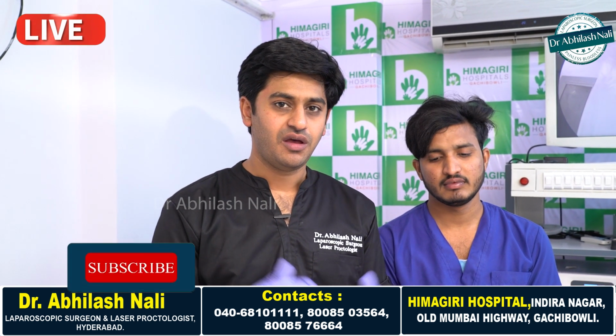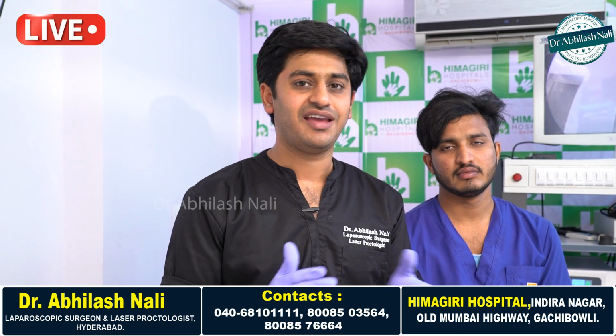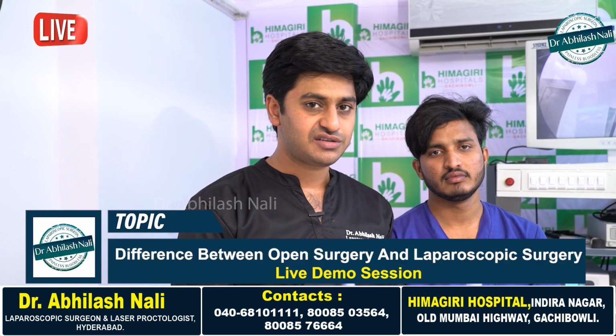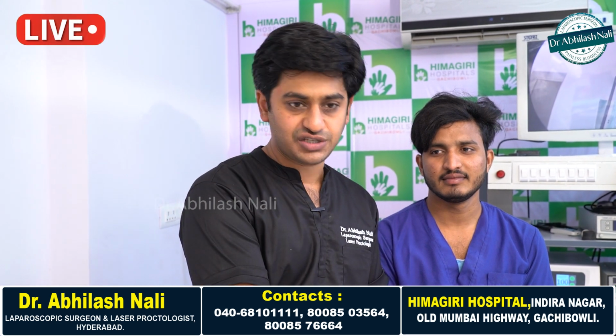In this video, in our previous videos, we have discussed a lot about the benefits of laparoscopic surgery over open surgery. But in this video, we are going to demonstrate live, on a virtual model, how open surgery will be performed and how a laparoscopic surgery will be performed.